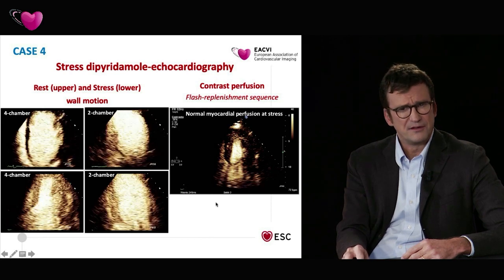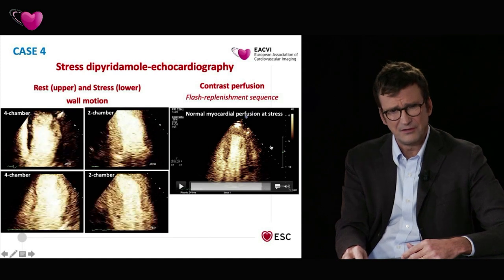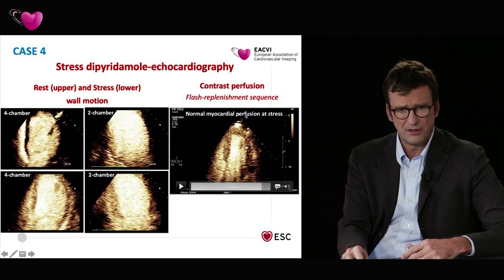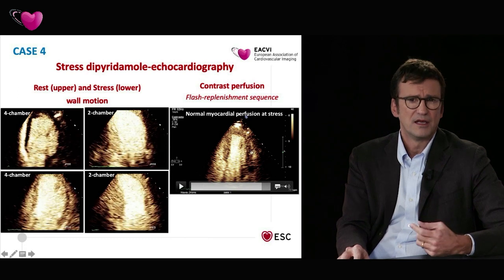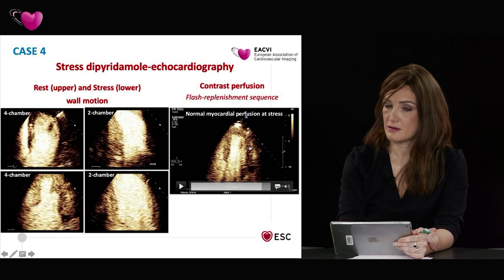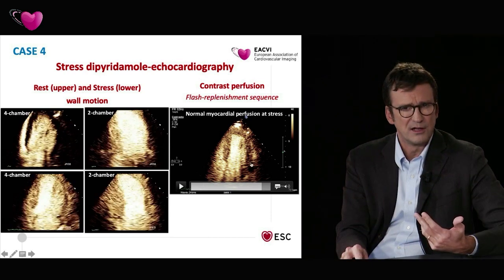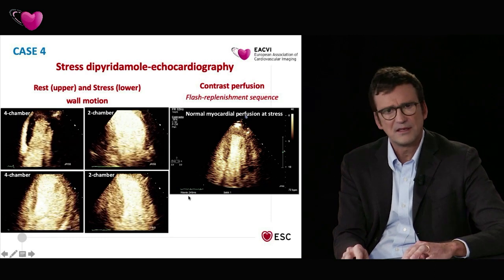See, this is after the flash, and then you see how it replenishes. This is an artifact. You always have to know and think about artifacts when you're using contrast, because artifacts are there as they are in 2D standard imaging, but you don't know that you're looking at them, so you just see less signal, but it may be because this is a side lobe and so on. So that's where the experience comes in.